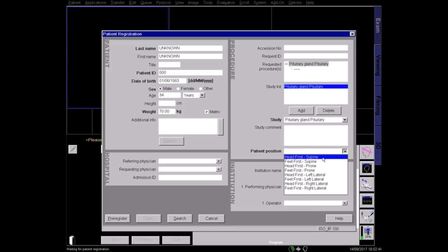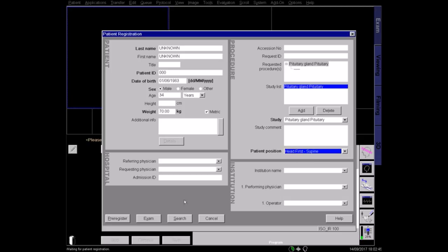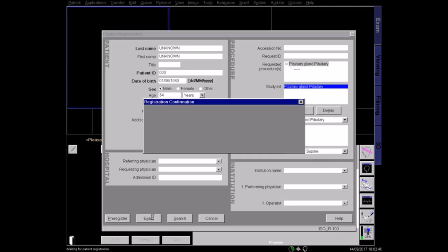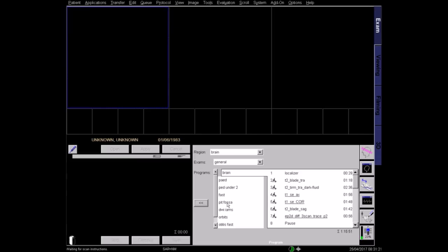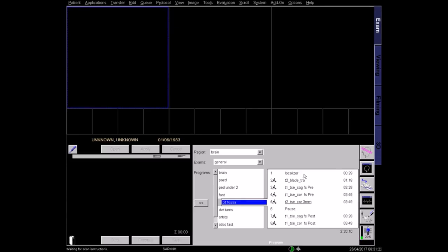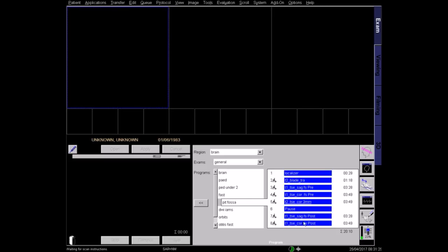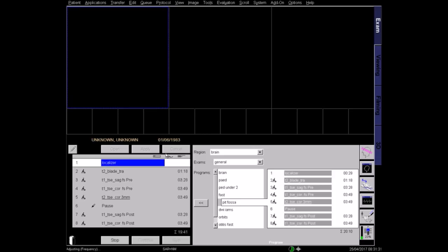Register the patient as lying head first and supine. Select the correct protocol according to your hospital and radiologist guidelines. Begin with the localiser sequence in three planes.